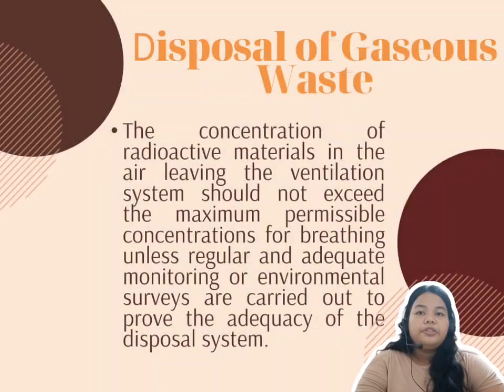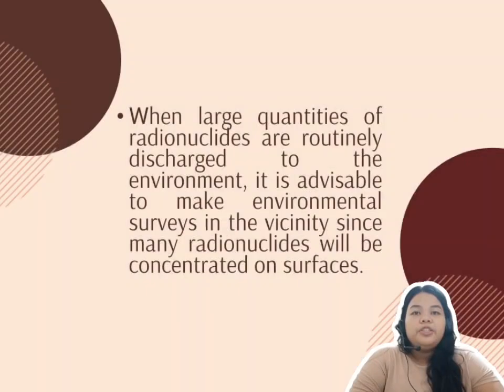The concentrations of radioactive material in the air leaving the ventilation system should not exceed the maximum permissible concentrations for breathing, unless regular and adequate monitoring or environmental surveys are carried out to prove the adequacy of the disposal system. When large quantities of radionuclides are routinely discharged to the environment, it is advisable to make environmental surveys in the vicinity, since many radionuclides will be concentrated on the surfaces.